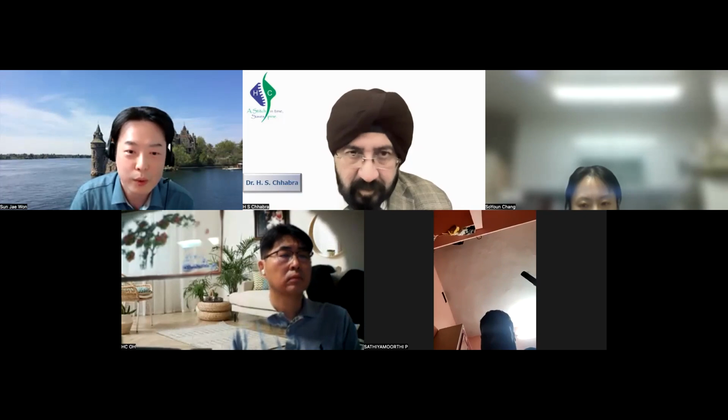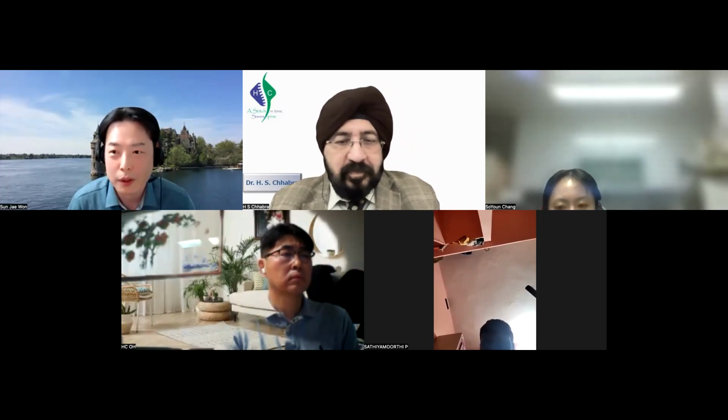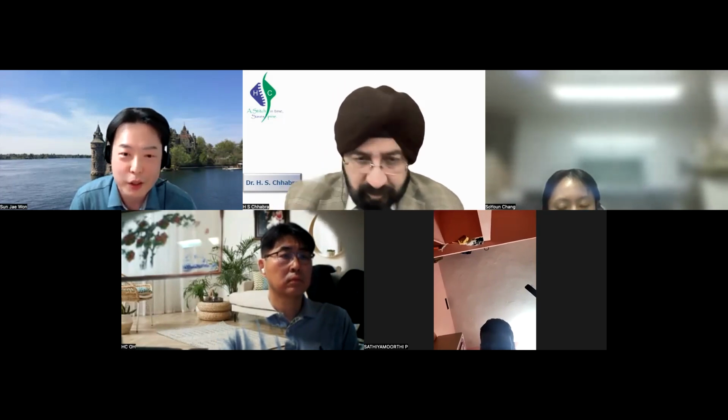So Dr. Mohammed Faisal wants to ask, what is the scope of this technology in the elderly population? Yes, so in elderly patients, the main effect of the rehabilitation robot will be to improve cardiovascular fitness and keep them in a standing position. Elderly people usually sit on the couch all day, so they do not walk. If we use a rehabilitation robot, it can substitute for the tilt table or that kind of rehabilitation process. So that will be the meaning of rehabilitation robots in elderly people. Yeah, that'll be different in young people.